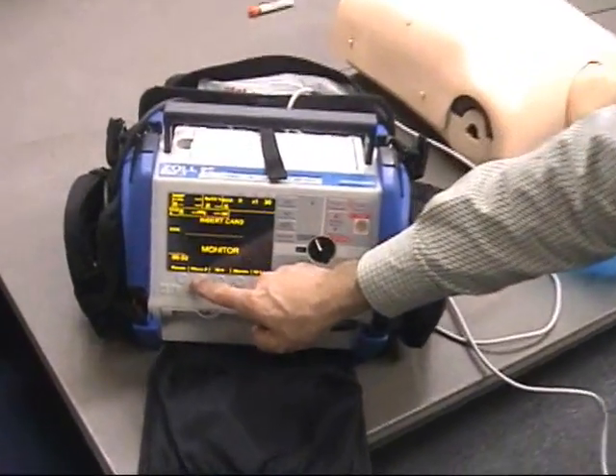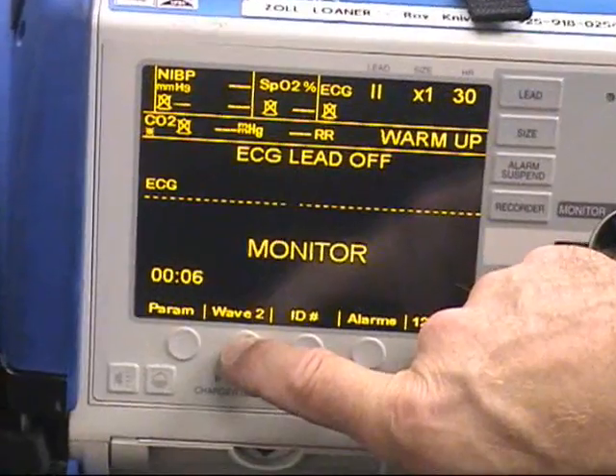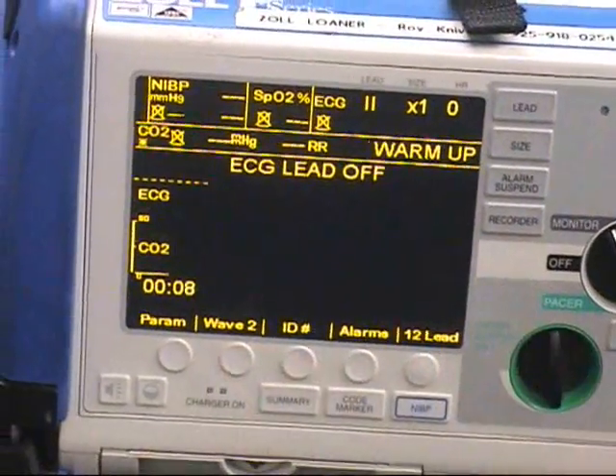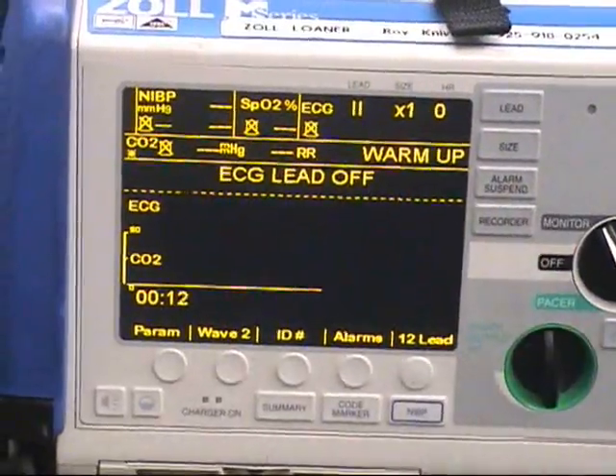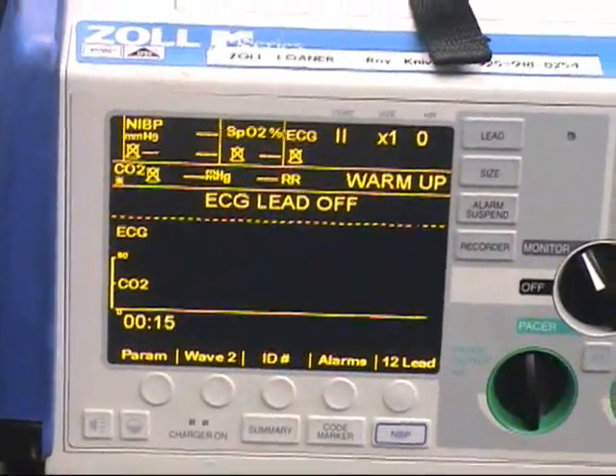Next, we're going to press the Wave 2 button to bring up the CO2 waveform on the bottom of the screen. You'll see that we're in warm-up mode, but it will display a waveform and a respiratory rate as you'll see in just a minute.